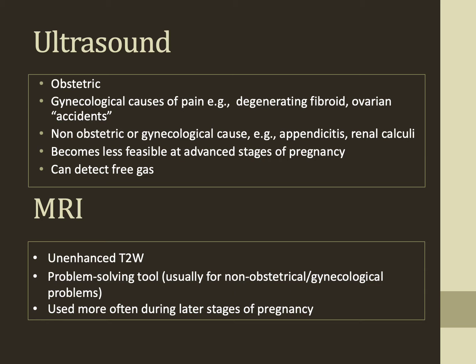MRI is increasingly recognized as a problem-solving tool. Due to the uncertainty of safety of gadolinium-based contrast agents, it is generally not recommended. So contrast is usually not recommended unless absolutely necessary for diagnosis. And MRI is used more often in the later stages of pregnancy.